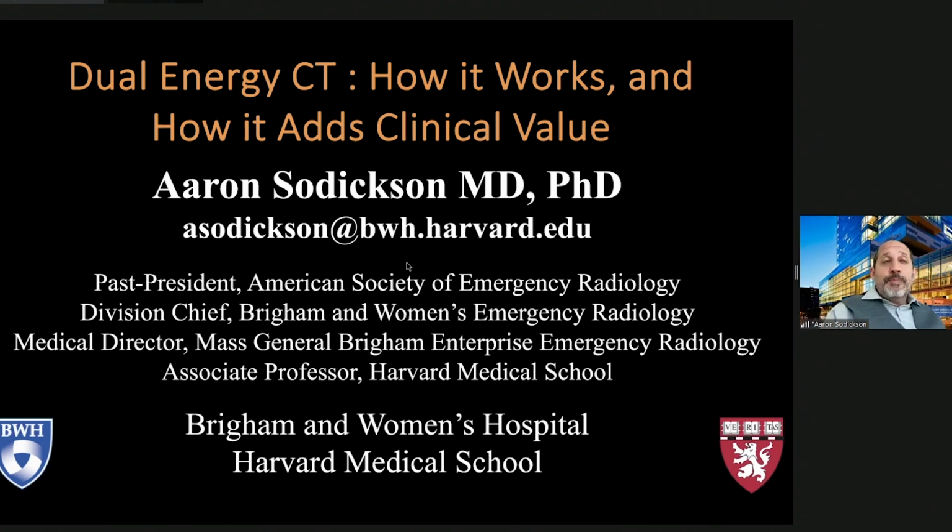and how much more are we going to add? So I think, in our process, it's really been about finding what are the applications where we find this most helpful. In the abdomen, for example, iodine overlay image and virtual non-contrast image, that's all that we send. We do send it in both the axial and the coronal plane, but we don't do all this other stuff.